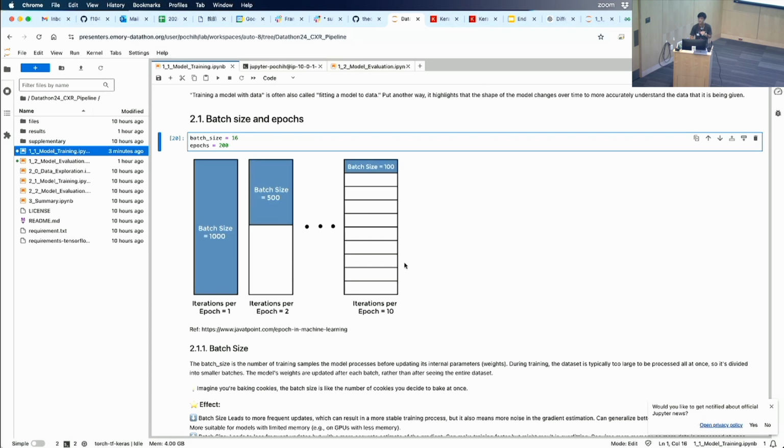But it's not that your model looks at all your data once and learns the right thing, right? Everything is stored in the loss function, with stochastic gradient descent. Your model may need to see your data 5 times or 10 times, but we don't know how many times it is going to be seen.